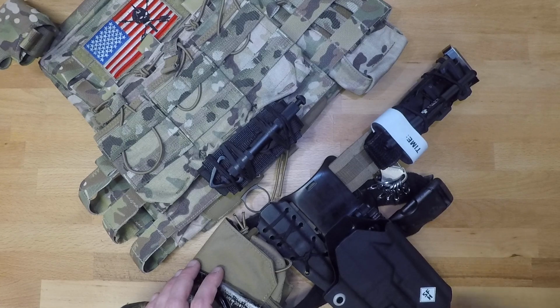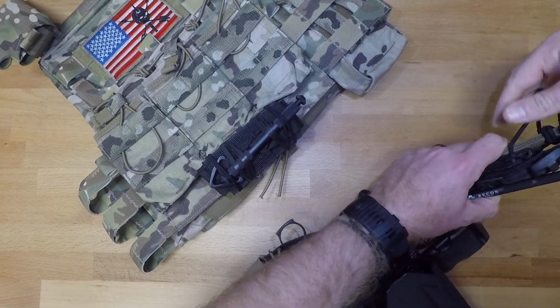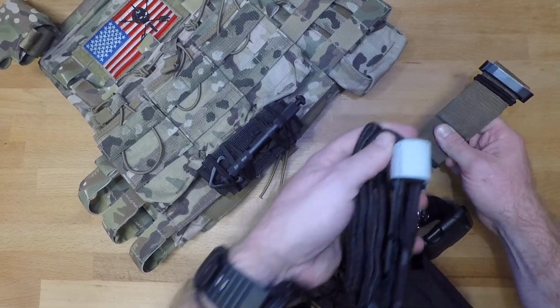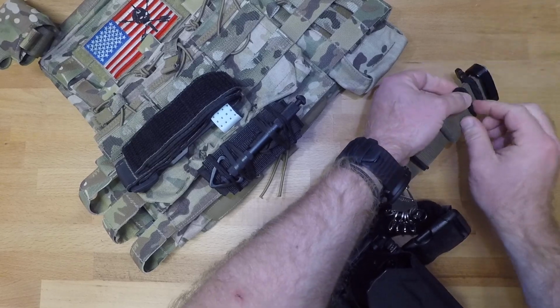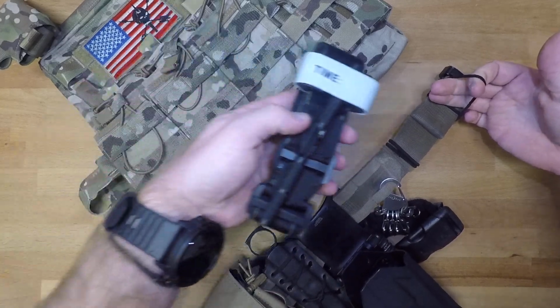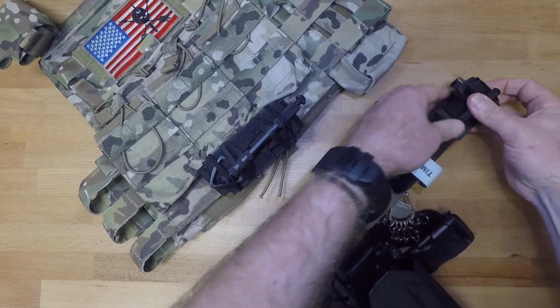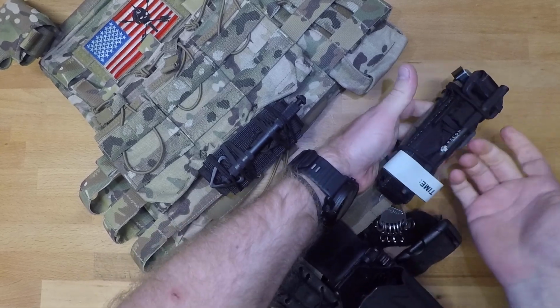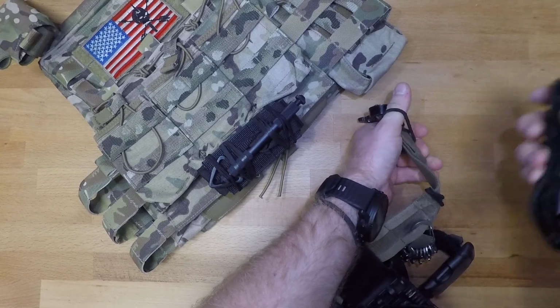So with that, real quick, just how you can set these up so that way you can actually see what it looks like for the setup piece. Just gonna pull this guy right out, and all you're gonna do is take these tourniquets, do a double wrap, so to speak, around the belt, and then that tourniquet is just gonna drop right into place like so. And then same on the other side. And then when you have to employ this, it just rips right out. Simple as that.